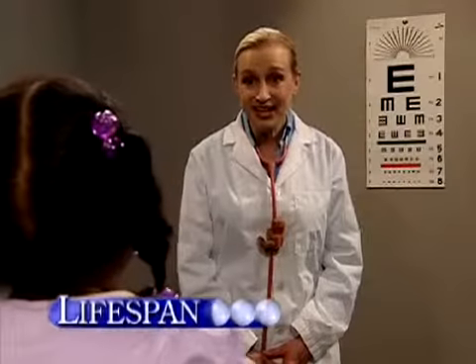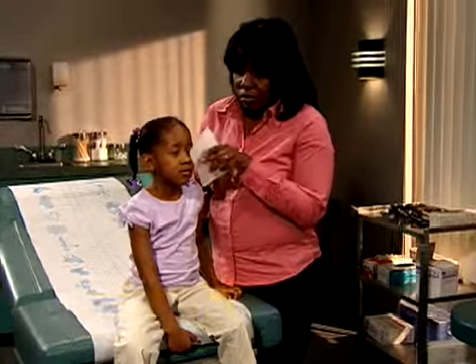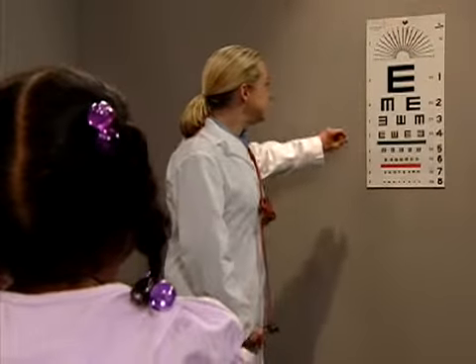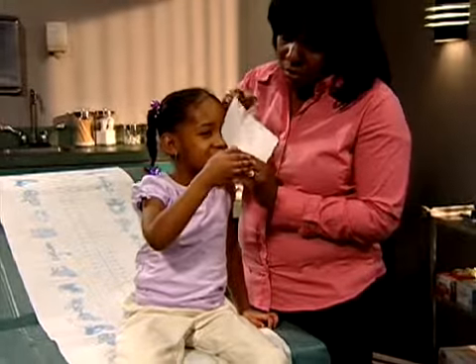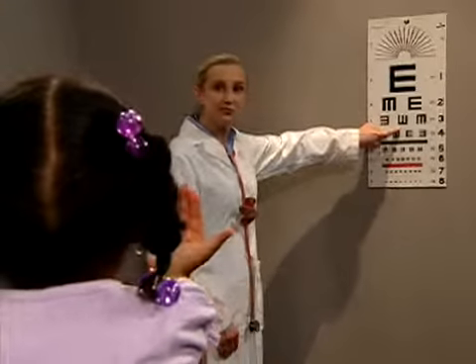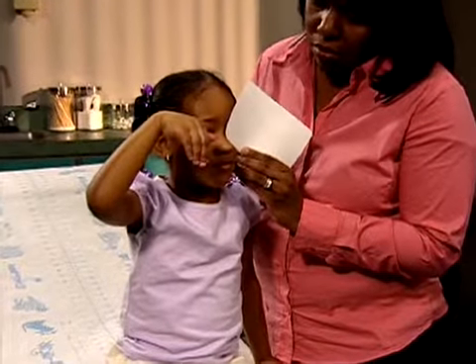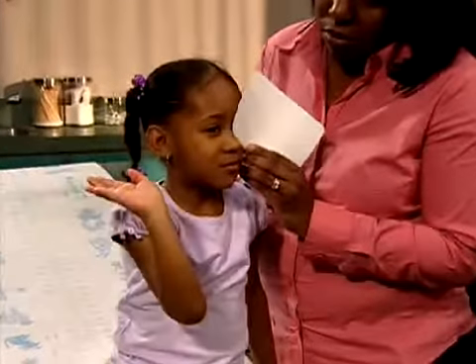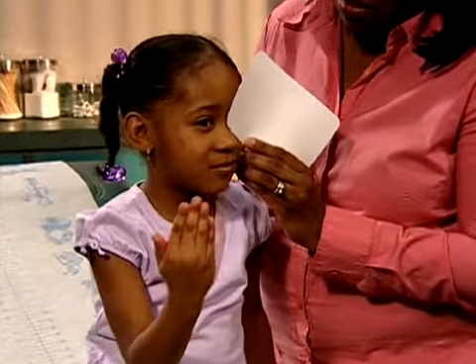Are you ready to play the E-game? Yes. Good. Okay, Mom, if you could cover up one of her eyes. For a child or an adult who doesn't read English, use a Snellen E-chart to test visual acuity. While you stand at the chart, have the child point her arms or fingers in the direction of the legs of the E. That's right. You may need an assistant, such as the child's parent, to help her cover one eye.